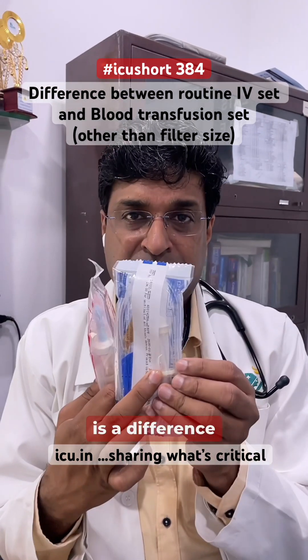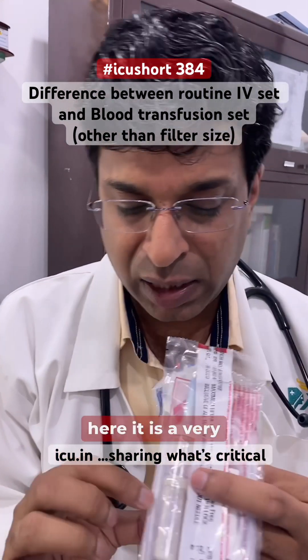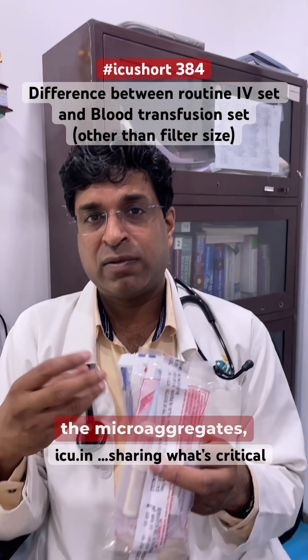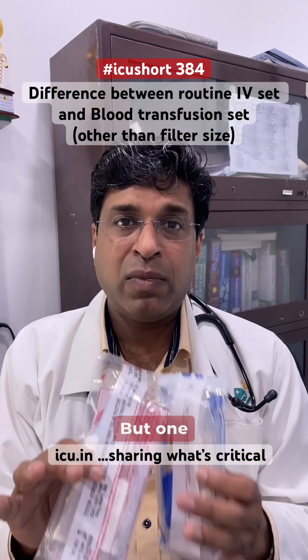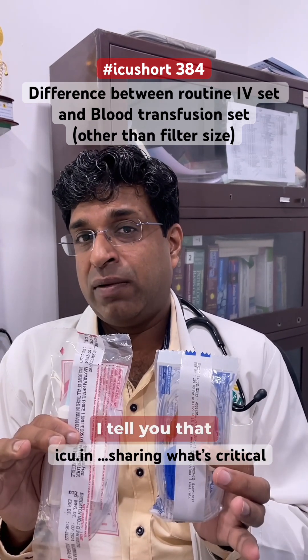One difference everybody knows is the filter size. On the IV set, there is a very small filter, and on the blood transfusion set, there is a very large filter. This large filter prevents microaggregates, fibrins, or blood clots from getting transfused.